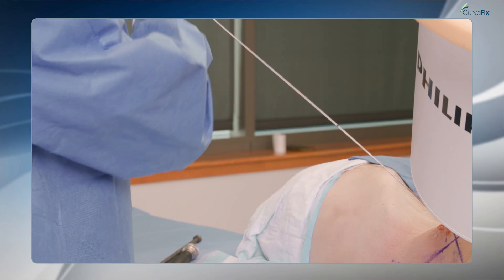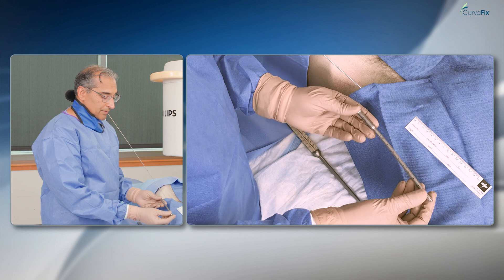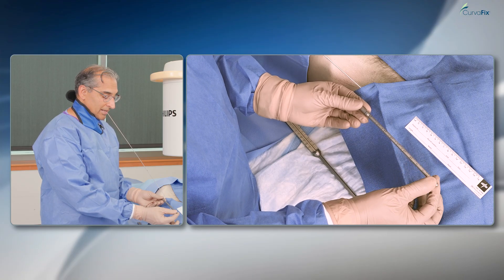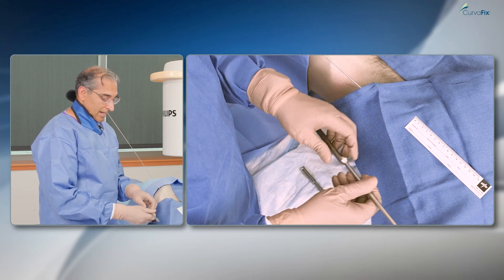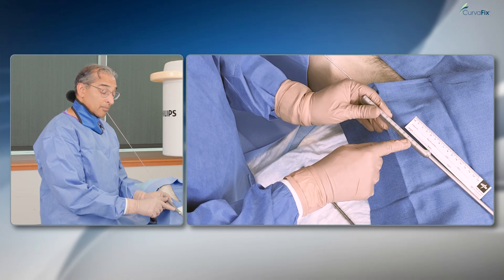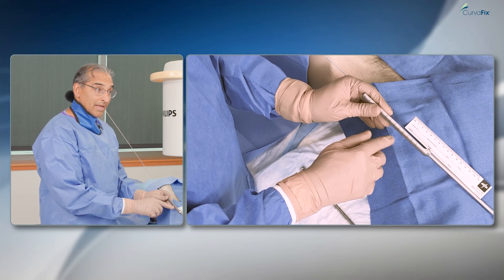I want to show an important feature about screw length. The wire is 190 millimeters down this posterior column. As you look at a 200 millimeter screw, notice the linkages in between. As the screw goes through the canal, it can actually increase in length, particularly when it locks. So while you might measure 200 millimeters, the screw can actually obtain a longer length — a 200 millimeter screw has the ability to become up to 215 millimeters.